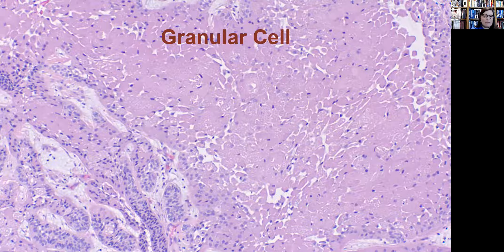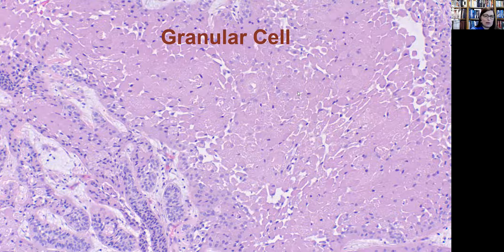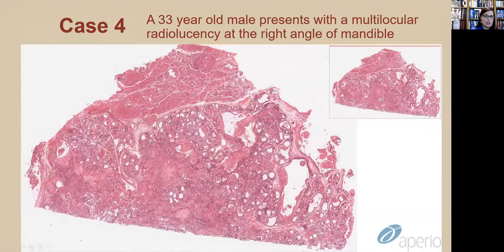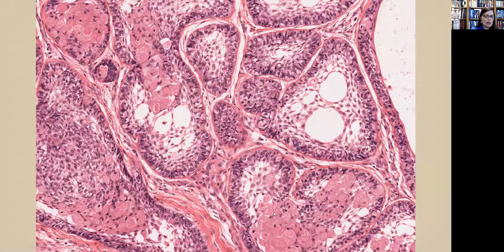The different histologic variants of ameloblastoma can often be seen in combination. One is the granular cell variant, which is from lysosomal aggregates. Here we see more conventional ameloblastoma with peripheral palisade, and then we see granular cell change. Case four is a 33-year-old male with a multilocular radiolucency in the right angle of the mandible. We see a follicular pattern with some cystic degeneration, and at higher power we see granular cell change — a mixed follicular and granular cell variant.